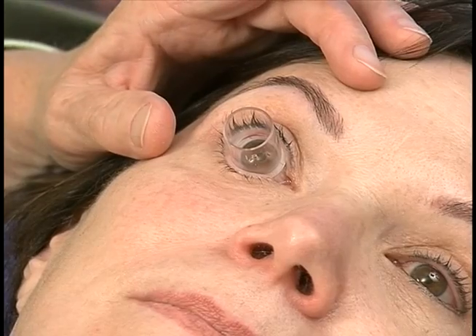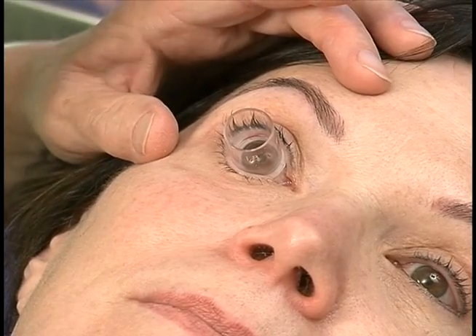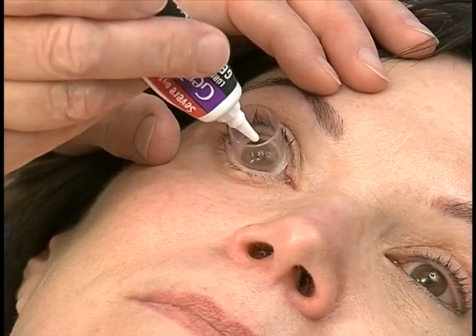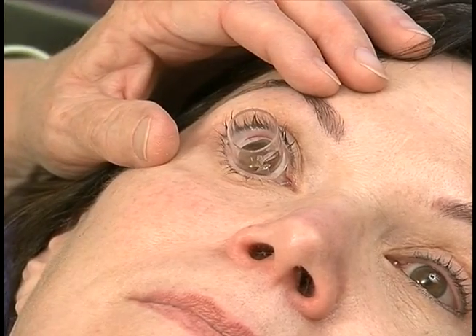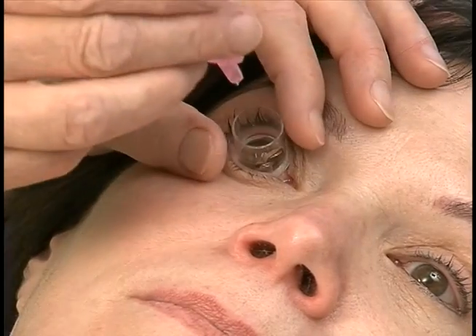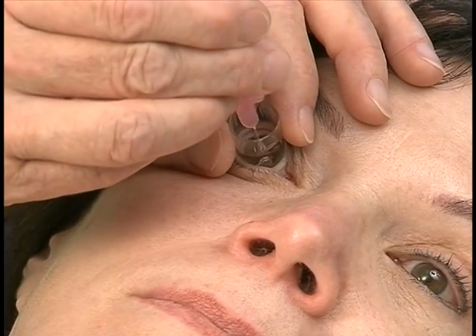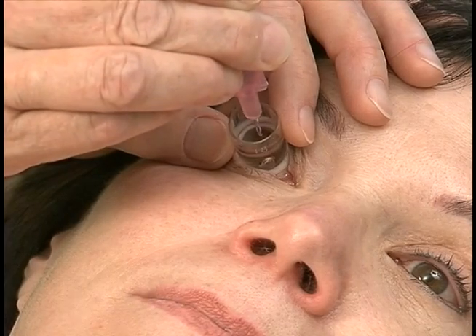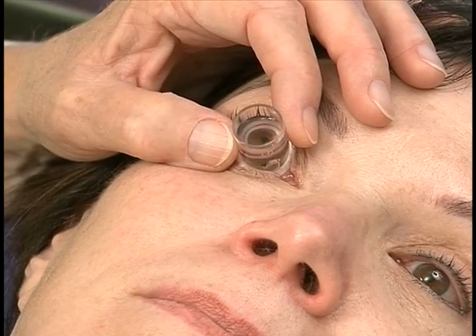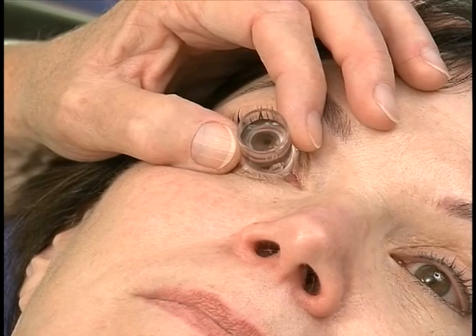Tell the patient to keep the other eye open. I add a little bit of genteal gel into the bottom just to add an extra seal. If you have a patient with a hearing aid, for sure start off right away with a tissue at the lateral canthus — do not let saline get to the hearing aid.